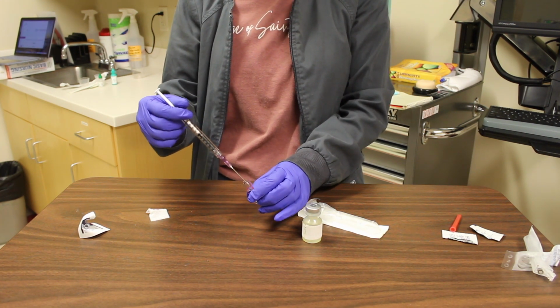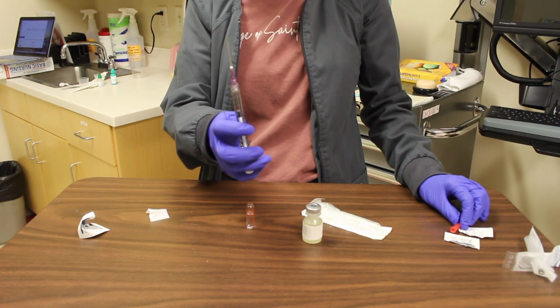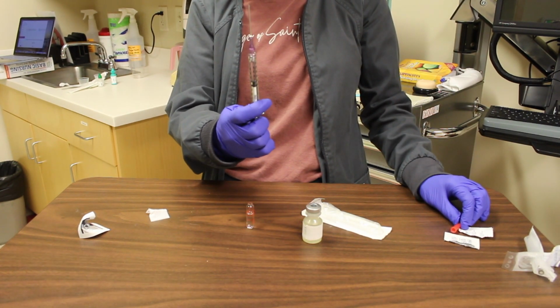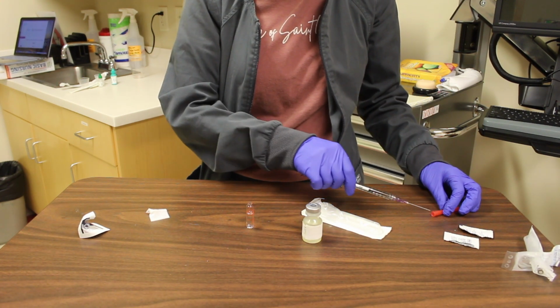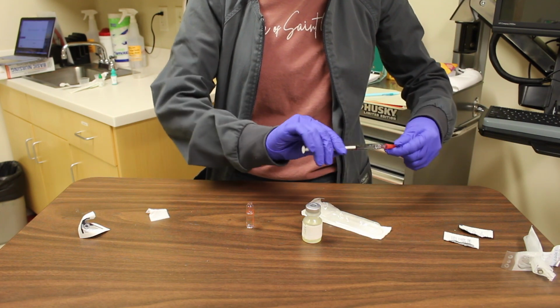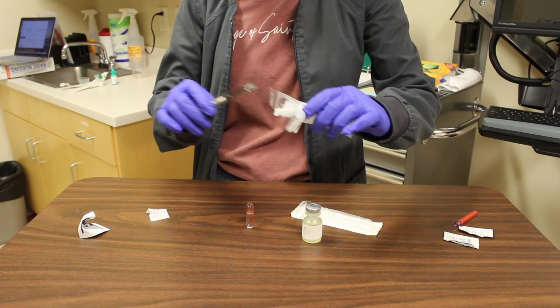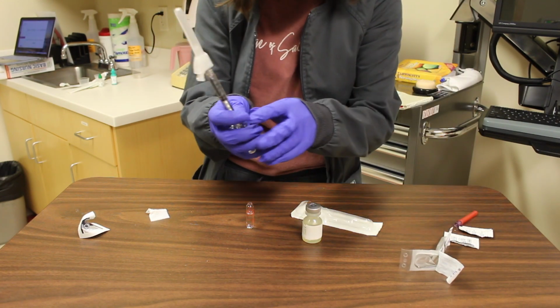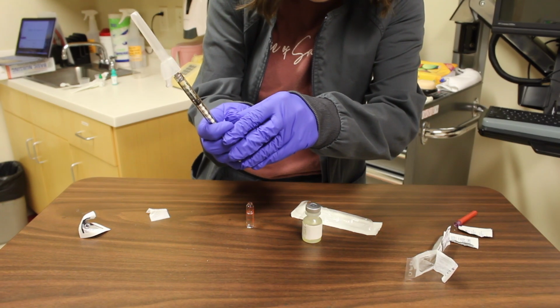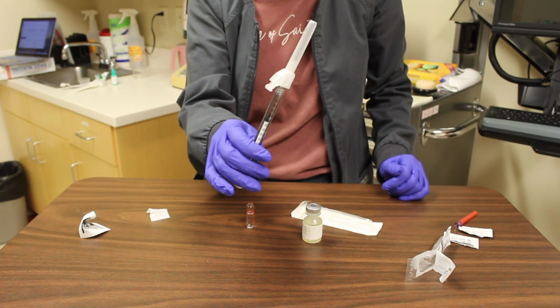After removing the filter needle from the ampule, hold the syringe vertically and draw back 0.2 milliliters of air into the syringe. Remove the filter needle and reattach the needle that is needed to be used for medication administration. Once the correct needle is attached, eject the 0.2 milliliters of air and read the dose. Make sure that this dose is still the amount needed for the medication administration.